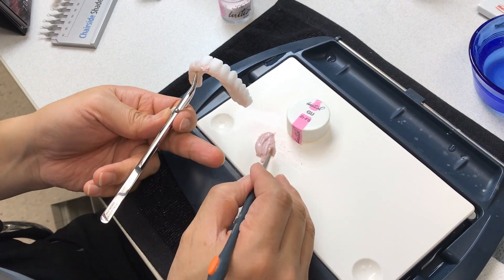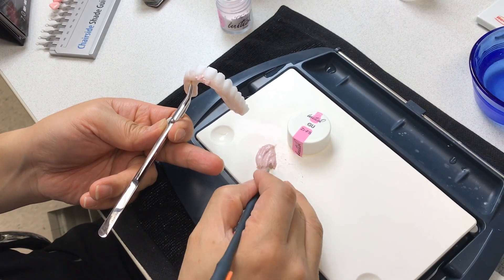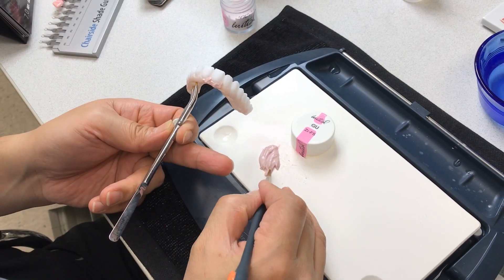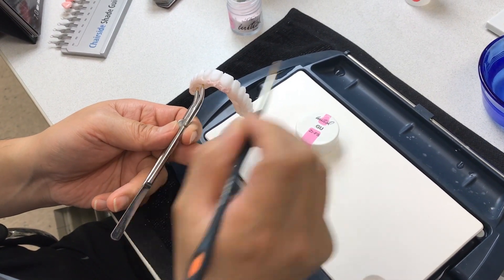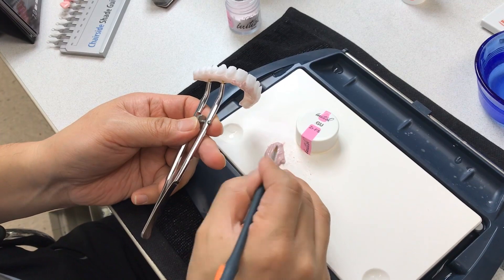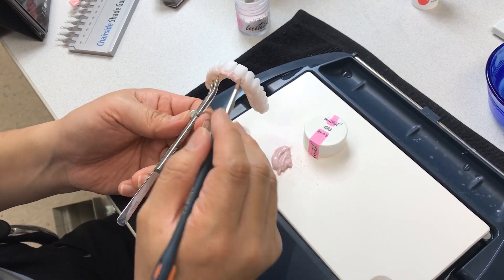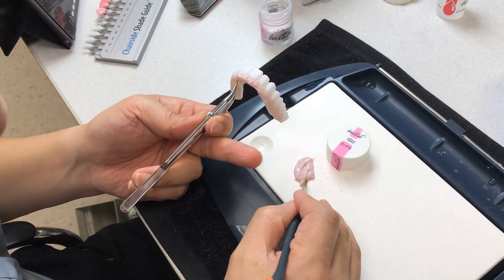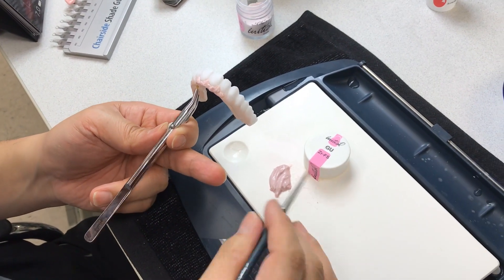So I build up — I try to put the creation, the regular foundation. Tissue is extremely important. Trying to make the tooth contour, decrease it, increase it — the size of the tooth is very important.